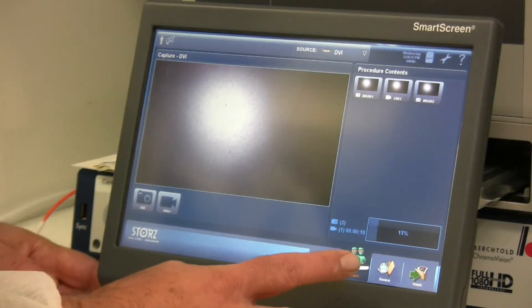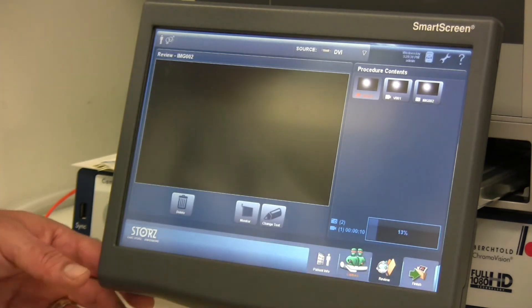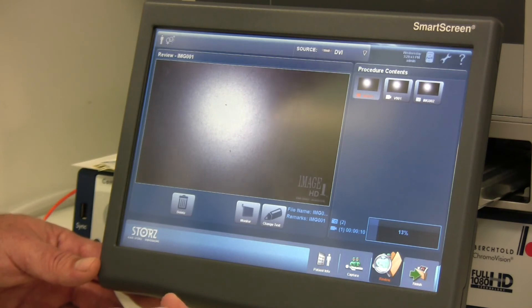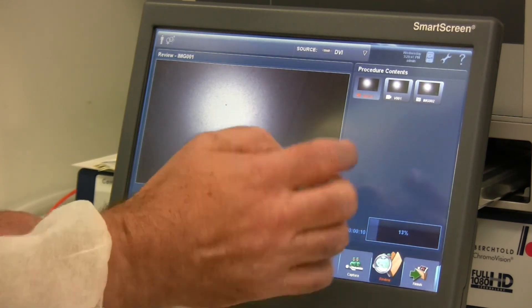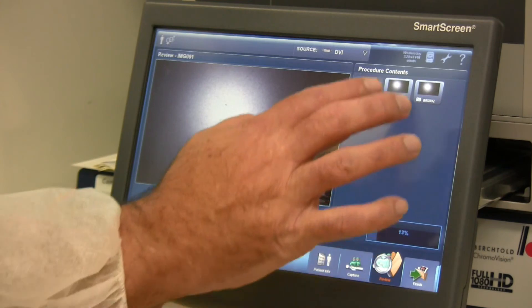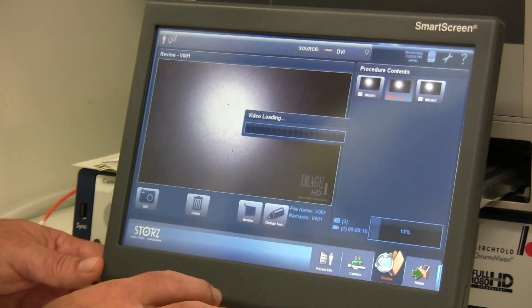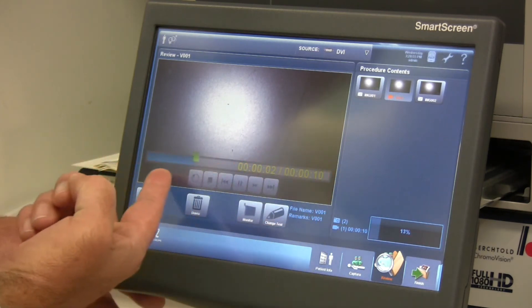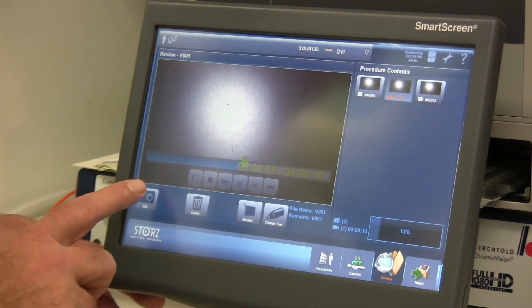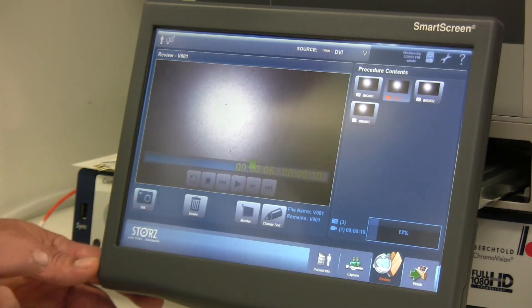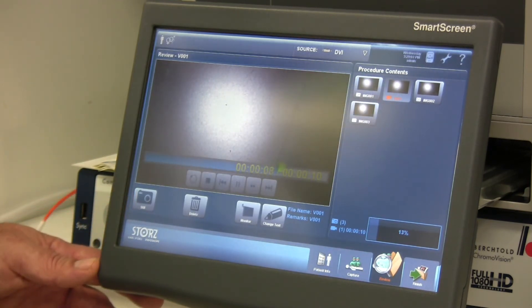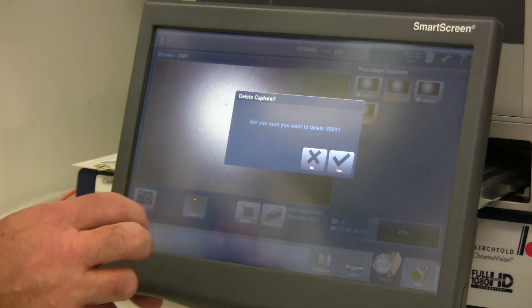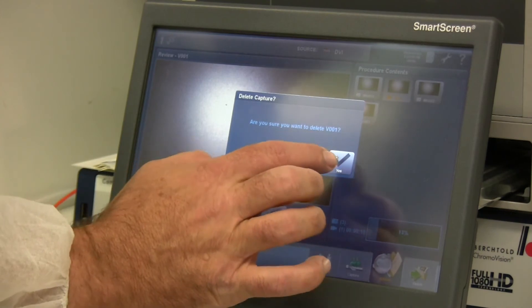The next section is the review section. If I press this icon, I can see all the images and video clips taken in this case. I can select a video file, it will load and start playing. If there's a moment in the video clip I want a snapshot of, I can do that from the image capture device as well. From here, I can also delete files from this case, removing them from that instance.